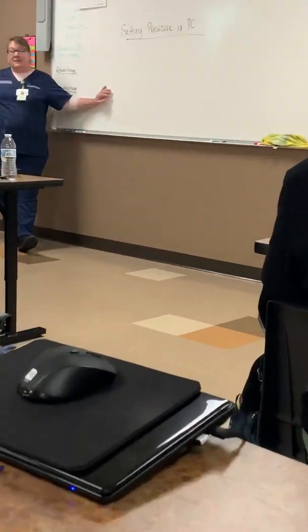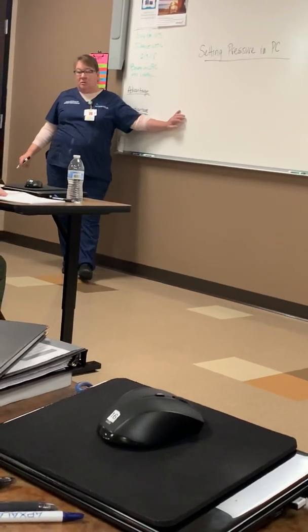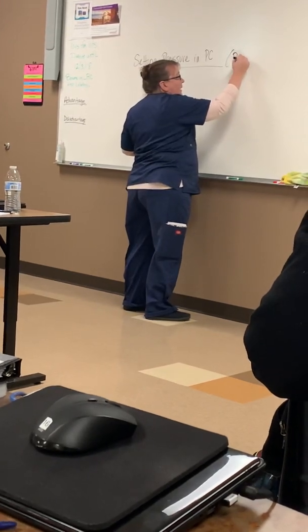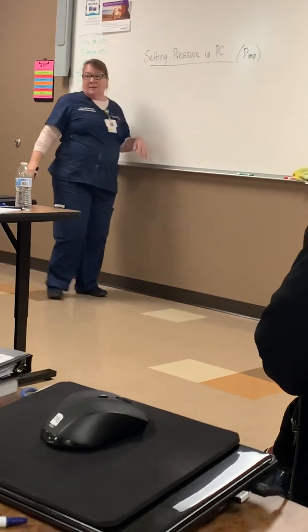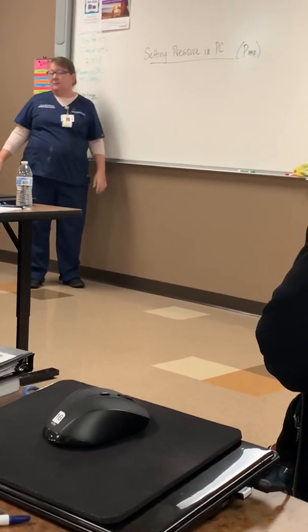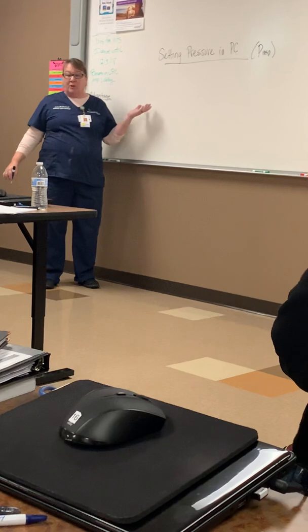control. Do not for PRVC, because that's going to be set in alarms. This is in pressure control. It's generally going to be the PINSP. Like people are always like, where do I set the pressure? It's the inspiratory pressure setting, wherever you see it in the settings part of it, but same place where you set the rate. There'll be no tidal volume to set, only a pressure.